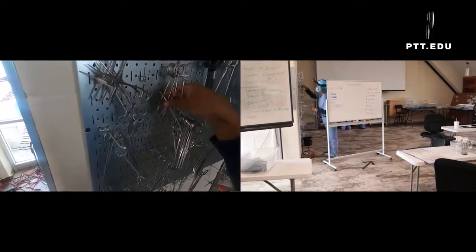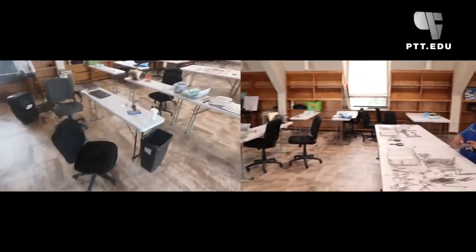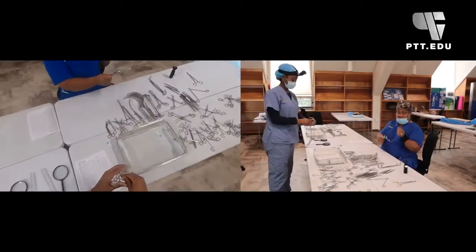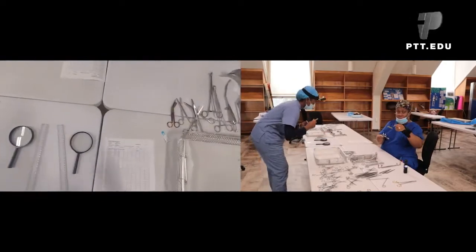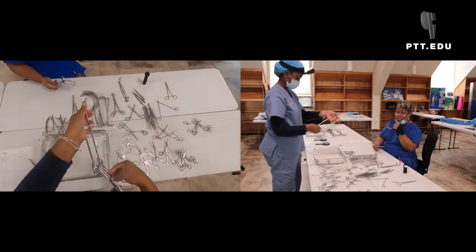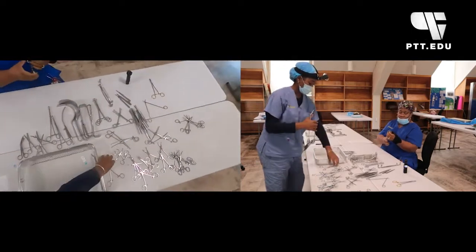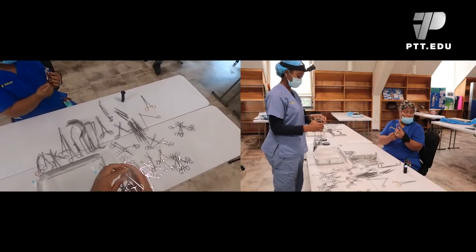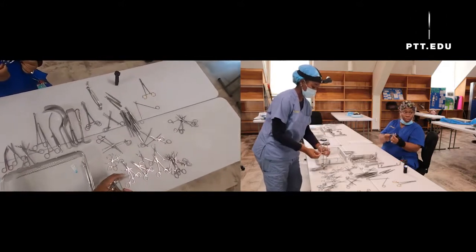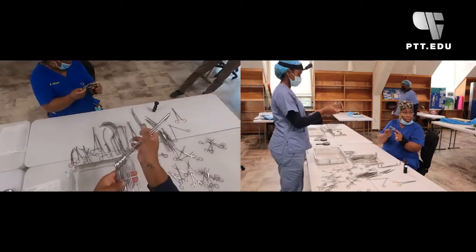Some important things about a Weitlaner. It is a self-retaining instrument, which means that this locking mechanism here, once you place it, will just stay there until someone physically moves it, whether it can expand or whether it can retract. So one of the things when we're in sterile processing, we have to make sure that all of the ratchets and the grooves are actually clean, and make sure that it looks like two little rakes on the side. So when it's actually inside of the body, blood, bone, tissue, all kinds of the yucky stuff that goes on in surgery likes to get caught up in these prongs.